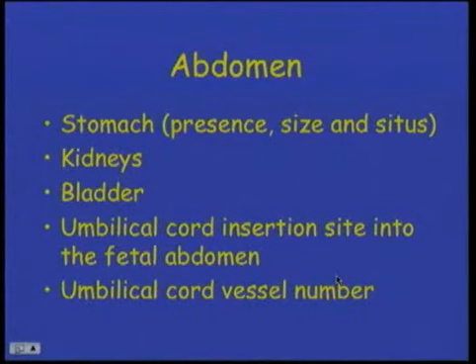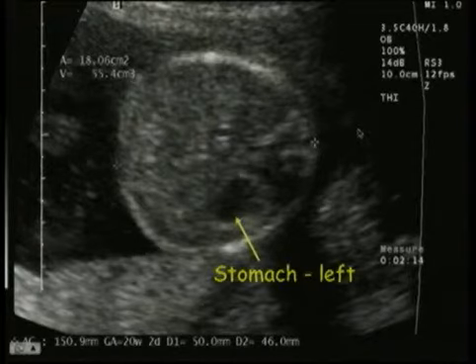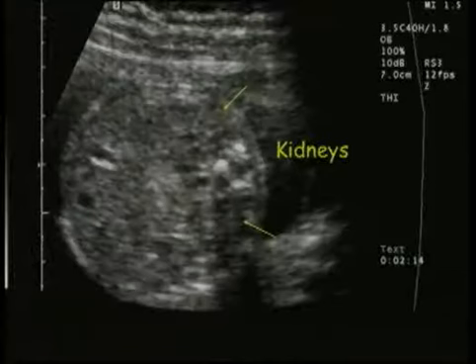We move on to the abdomen. We look for the present size and situs of the stomach, meaning whether it's on the left or the right. We look at the kidneys, the bladder, the umbilical cord insertion site into the fetal abdomen, and the umbilical cord vessel number. So here we have the stomach on the left and the spine is over here, and you have to know the position of the baby, that this is in a cephalic position with the spine to the left and the left side down.